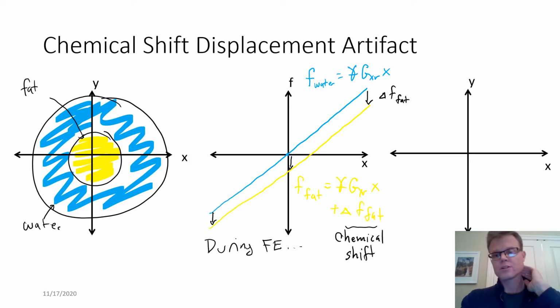So let's look at what our normal imaging problem would be. Say we look at some points here in our water at the edges. These points in X are going to map to these frequency values.